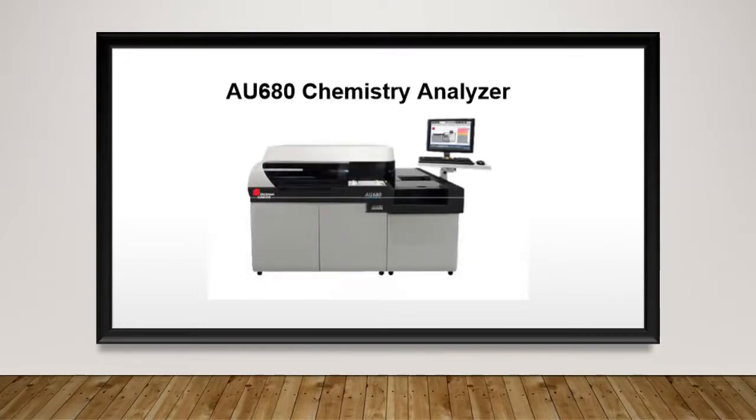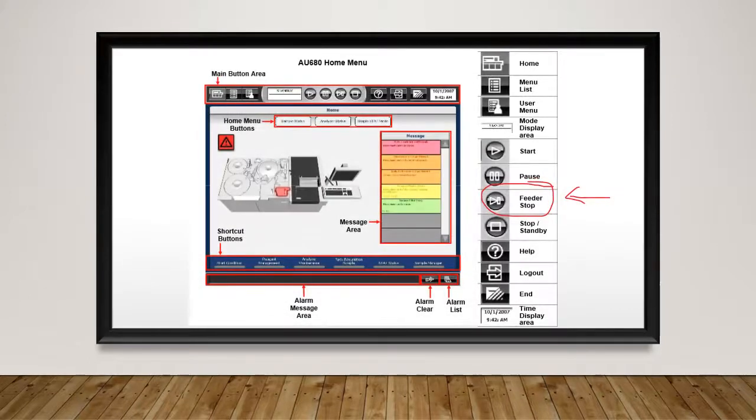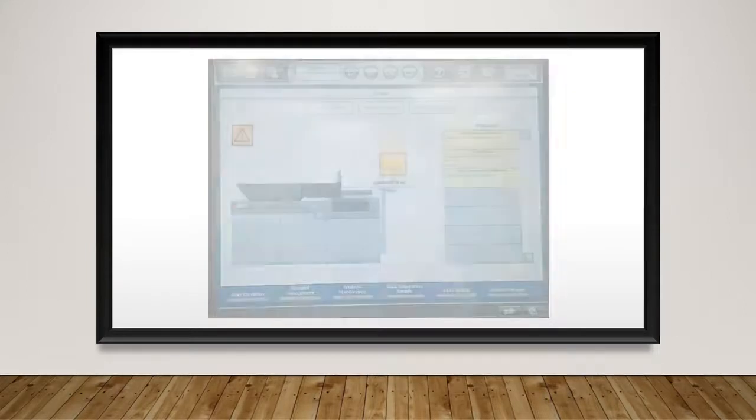Before we begin, the analyzer must be in standby, so select the feeder stop button. This will allow the analyzer to continue measuring ongoing tests before going into standby. Once in standby, we'll be ready to begin daily maintenance.